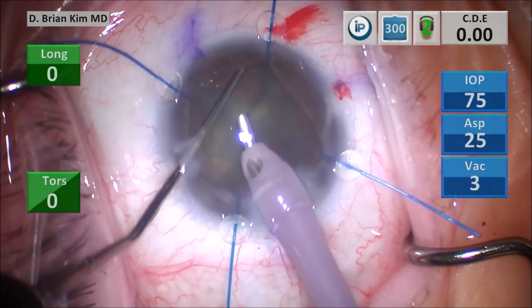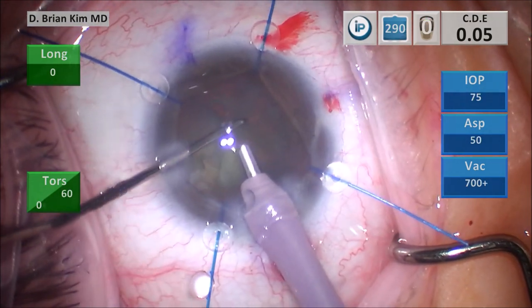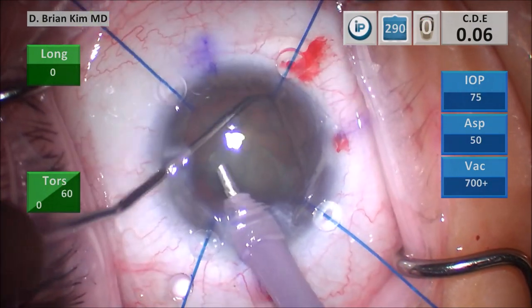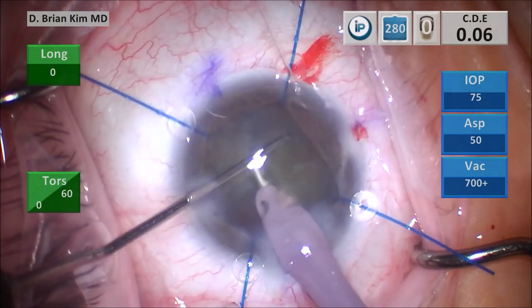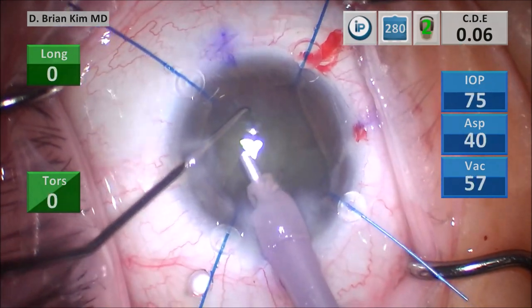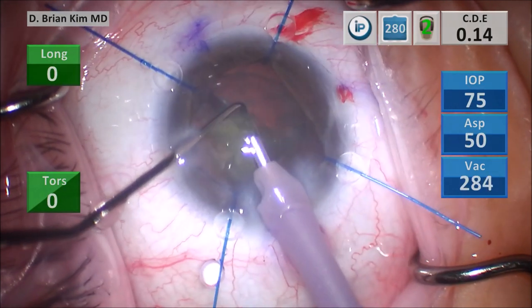I place the chopper out to the contralateral equator, pull it towards the faco tip, and crush the right hemi-nucleus — this is the cross chop maneuver. I'm being very ginger and careful as I disassemble this lens. I was able to prolapse one quadrant up out of the bag using the chopper, then pull the second quadrant out and begin crushing it with mechanical fracturing. The first two quadrants are out. I place the chopper again out to the equator, faco tip deep, pull the chopper centrally, and crush the second hemi-nucleus in half. I'm using successive mechanical fracturing forces to break the lens pieces smaller and aspirating them with high vacuum.